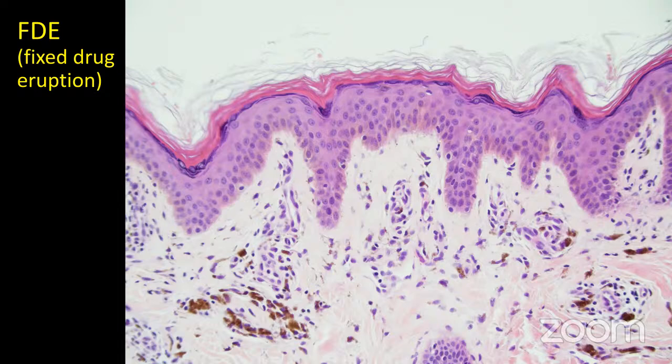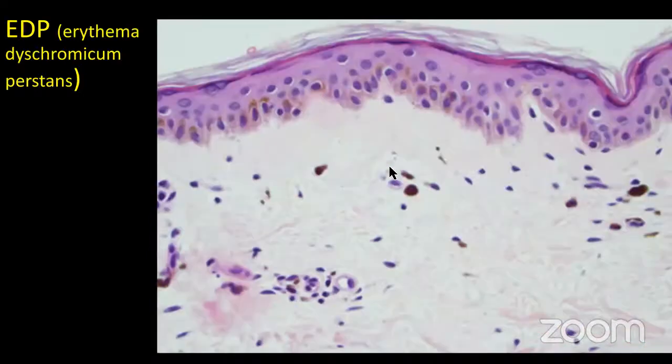But then when you take the drug again, it's usually a little bit of a delay. It's not every single time you take the drug, and it can even be a food too, but then it will hit it again. But this is a biopsy taken from a pigmented lesion, probably, or maybe a later stage.